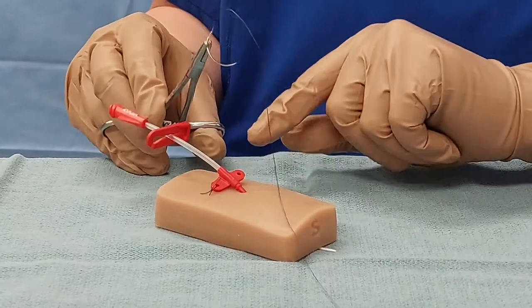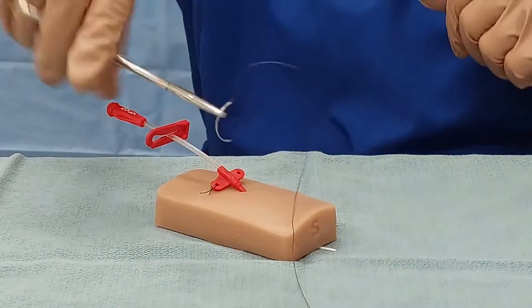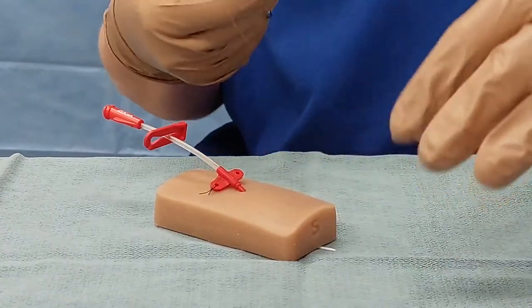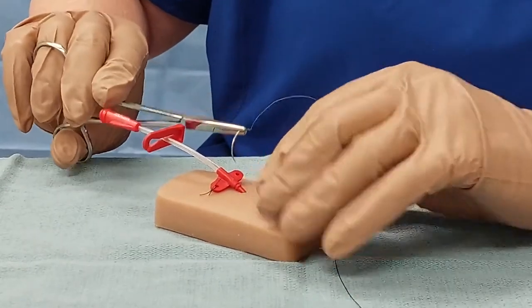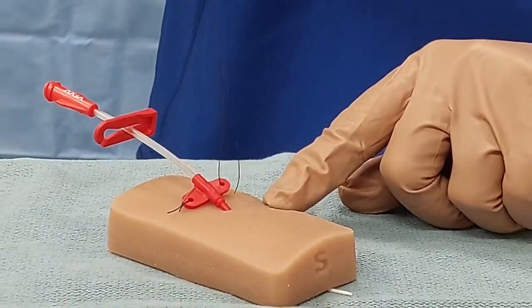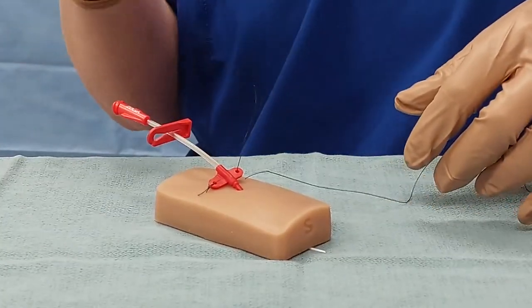On the other side, things can get a little bit tricky depending on your setup and how close the patient's arm is to their body. You may or may not be able to walk around them. If you can, get up and walk around to the other side so that you're pulling towards yourself. But if you're stuck on this side of the bed, adjust your body to get in there — it takes a little bit of practice. Or, depending on which catheter you're using, you can go through the hole and come out the other side. I'm grabbing about half a centimeter worth of skin and pulling that through. Then cut off your needle so that you're safe. For this side, I'll do the three, two, one sutures.